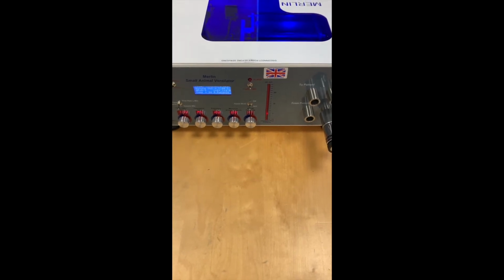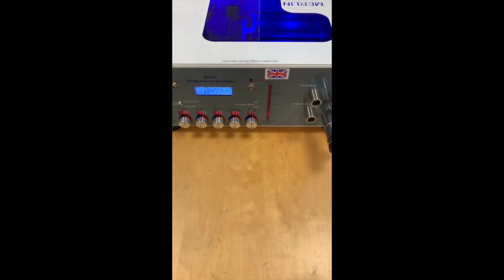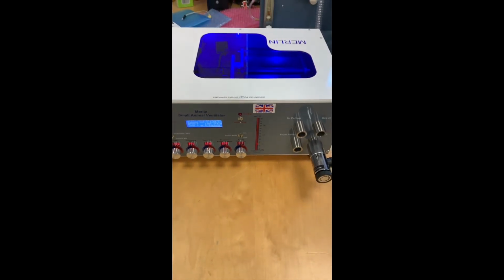It's had a few changes in that time, but it remains basically the same. But Merlin is basically an efficient syringe pump, driving a precision syringe with a very accurate motor. If I remove the lid, then we can have a look inside the machine and we can see how Merlin works.